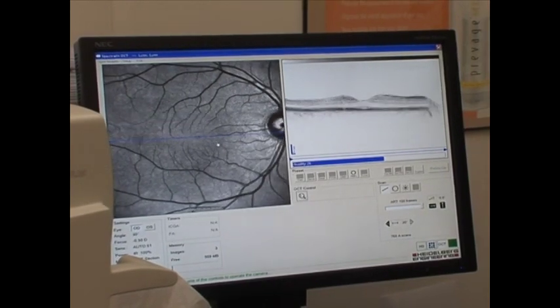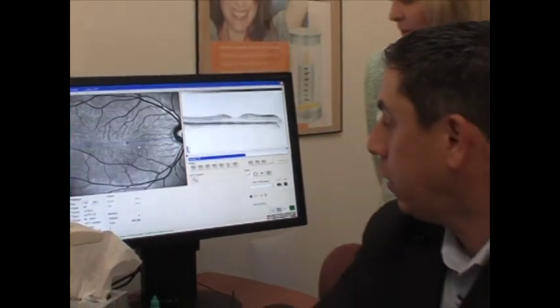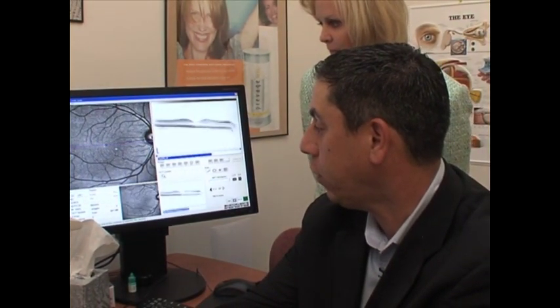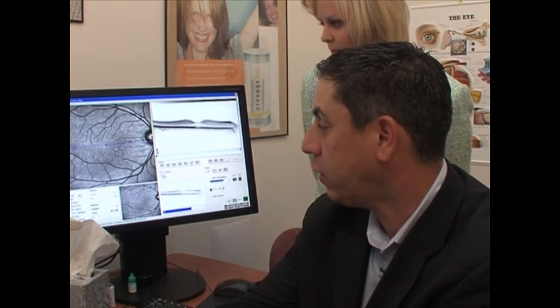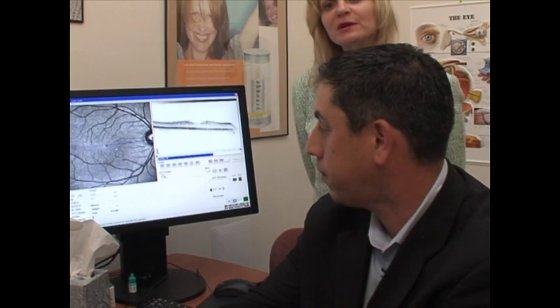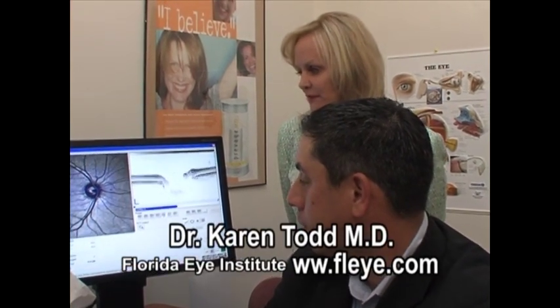We're going to look at her macula. The instrument allows us to lock with a retinal tracking device so that in real time, if her eye is moving, the instrument knows it's moving and is able to take a baseline image anywhere inside the retina. That's especially important in patients with head tremors who have difficulty sitting still, as we all have more difficulty with that as we get older.